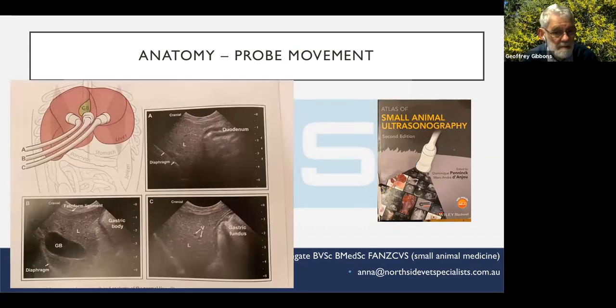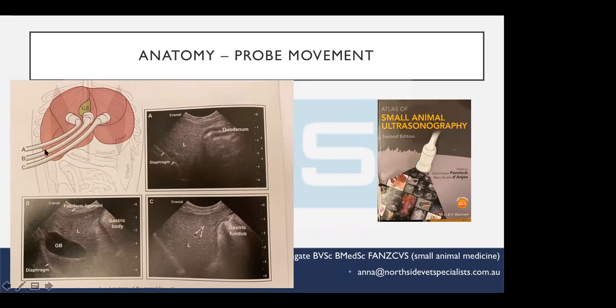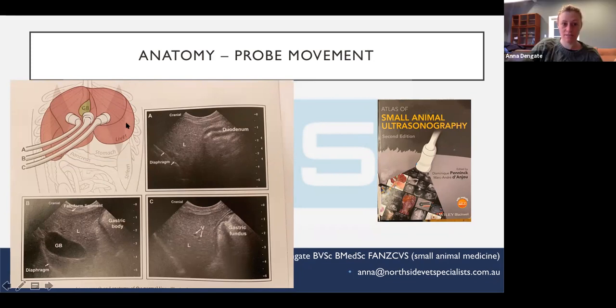Yes. Whereas on this one, that's the view I do to check how much liver is cranial or caudal. And if my probe's right there, pretty much all the liver is up there, and there shouldn't really be any liver on this side. Yep, no, the liver in this diagram is extending well beyond the costal arch. See that?